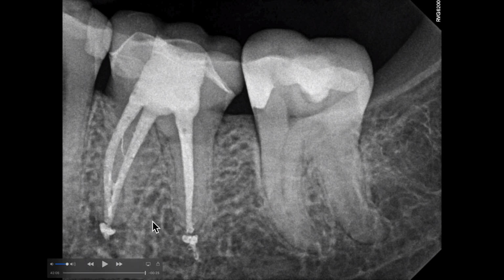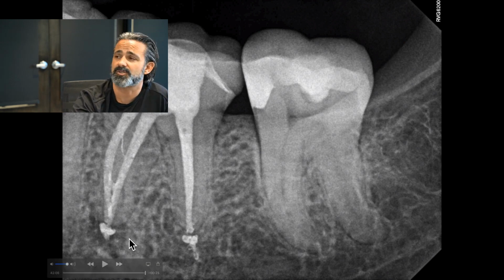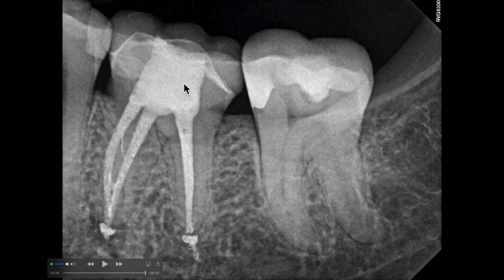But it's something that we follow and we like, and I believe this is an upgraded root canal in a retreatment scenario. In a lot of scenarios, they believe that. Like I said, good protocols. I've noticed that, we all have noticed that we're not 100%, and hopefully we are near to perfect, but sometimes we need a little extra, and I think this is the little extra we need to give our patients a very, very good outcome. And again, look at the seal of the crown. It's well adapted and intact and set. So there you go. Hopefully there were some pearls of wisdom.